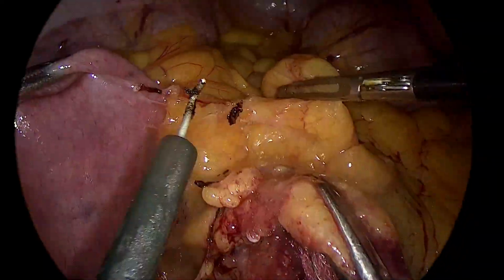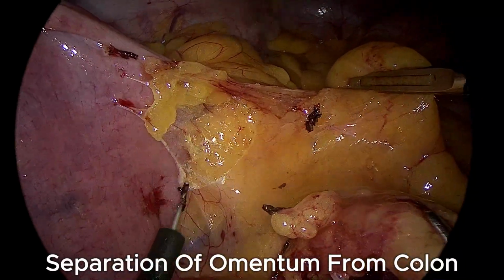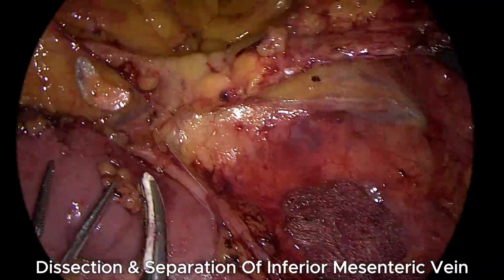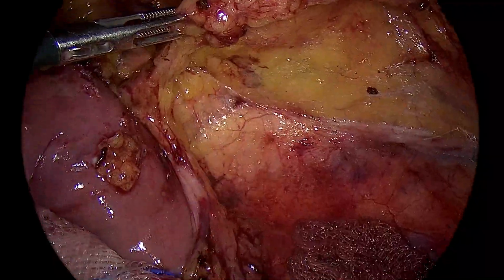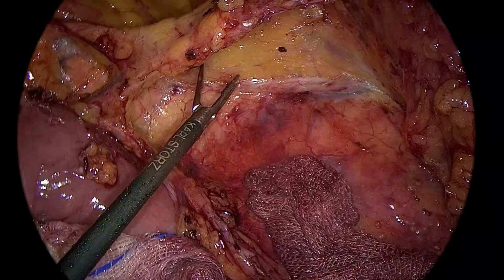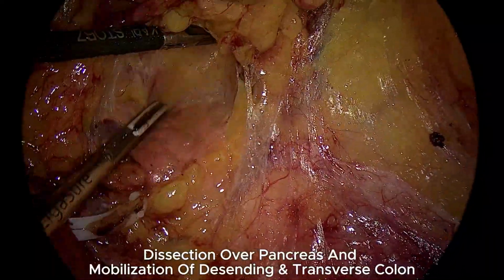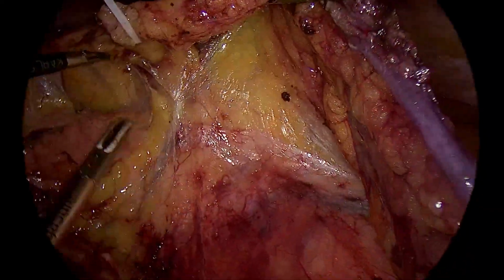Now we are separating omentum from the descending colon, and after this we did further dissection and inferior mesenteric vein is clipped proximally and divided with ligature. Now we are doing dissection over pancreas. As you can see here the whitish pink pancreatic tissue after lifting colon.